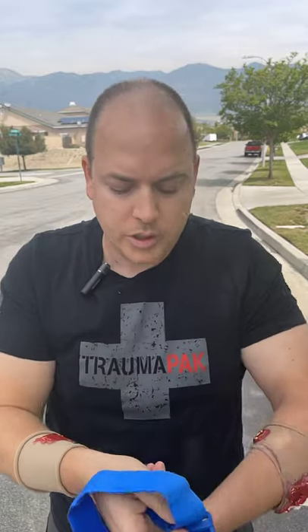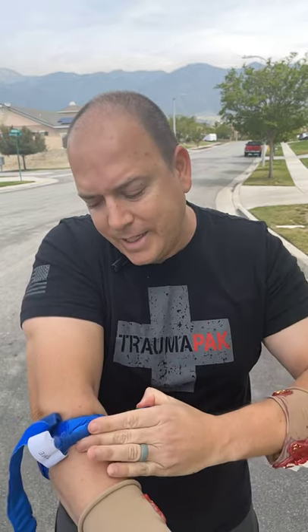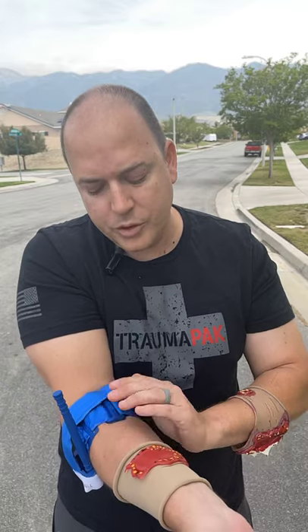So when do you go two to three inches above the wound? We look at the wound here — I take the palm of my hand and put it over the wound, that gives me two to three inches. If I'm in an environment where I have full light, I'm not afraid of any hazards, it's not a very dynamic environment, and I have time to expose the wound — maybe I pulled them back to an area with enough cover and time to make a good decision — I can look, get a couple inches above the wound, and go just above it, then pull my tourniquet tight. Take all the slack out — this is one of the common mistakes. Turn it as tight as I can, stop all the bleeding, bring my strap through and close it off. Why is this better? Less tissue to compress than up on the arm, and this is going to give me optimal success.